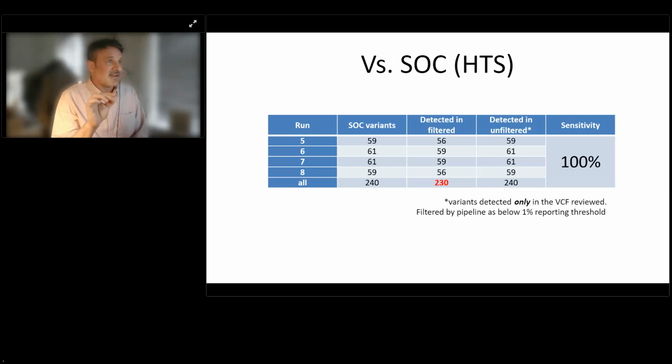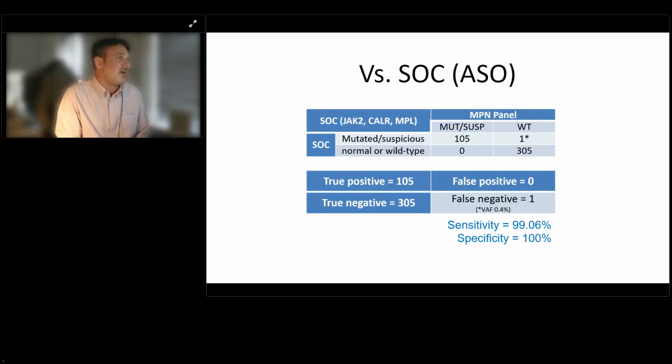So really, the sensitivity, it's just a case of tweaking your parameters on your pipeline. And we found that actually in the variant call files, those variants were recorded. It's just that we'd set our parameters not to return them because they were slightly below our limit of detection. And you'll remember I said we'd included some samples which had very low level variants included. So we were really testing the lower limits of the detection for this test.